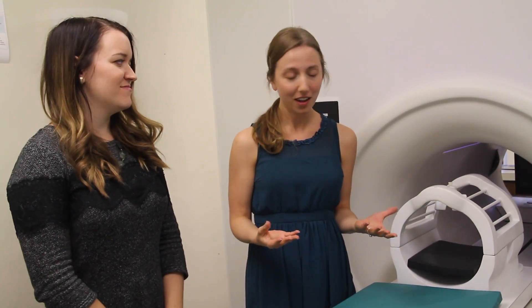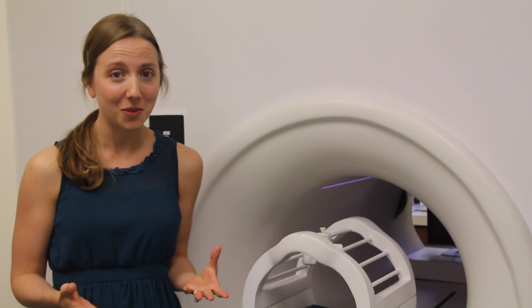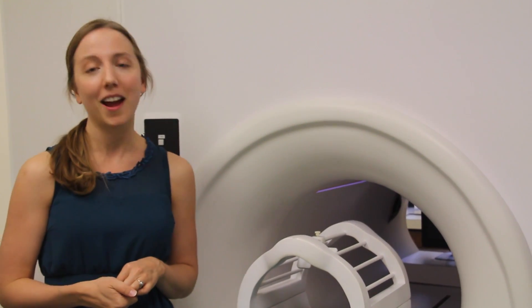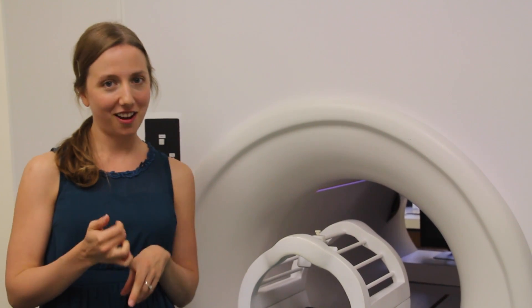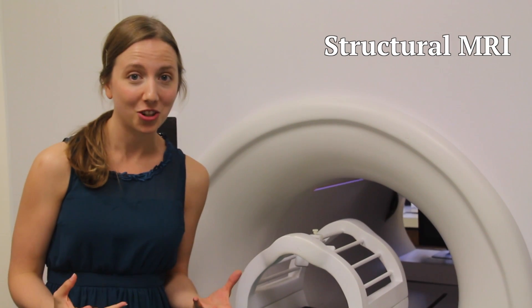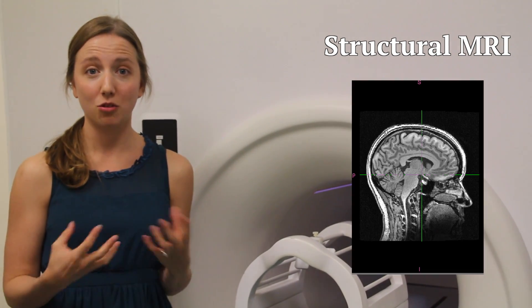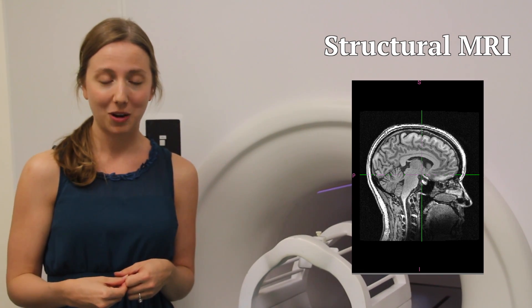MRI is a great way to study brain development in children because we can do MRIs — like EEG — with infants, with preschoolers, with adolescents, and with adults. There are three main types of images we can get from the brain using MRI. The first is called a structural MRI image, which tells us about the structure of the brain — we can actually see the brain's gray matter and white matter, the neurons and the connections running back and forth between them.